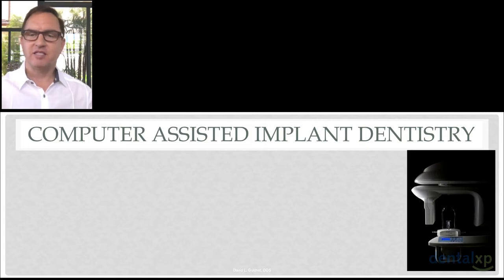So in the context of assisted implant dentistry, computer-assisted implant dentistry, we're talking about making investments, making sure those investments work for us and make us more efficient, not obsolete or extinct.